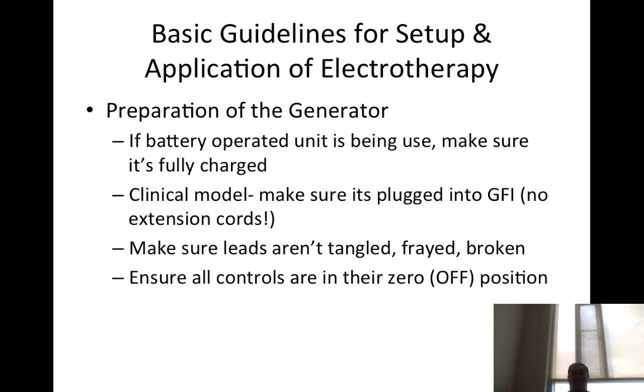So basic guidelines and setup for application of electrotherapy: prepare the generator. If it's battery operated, make sure the batteries are fully charged. Clinical model, if it's not a battery operated one, make sure it's plugged into a GFI, ground fault interrupter. Remember, I don't have one actually in my office here. This is the thing that most people have in their bathrooms that you plug your hair dryer or straightener in. It might cause a surge in electricity and you have to reset the unit, right? Push the little button in.